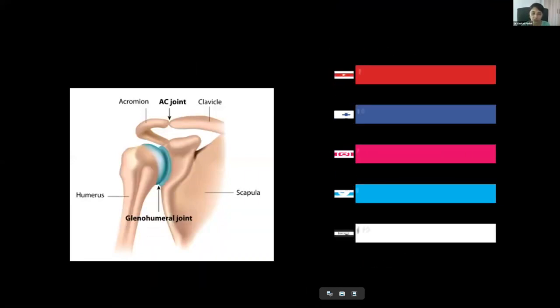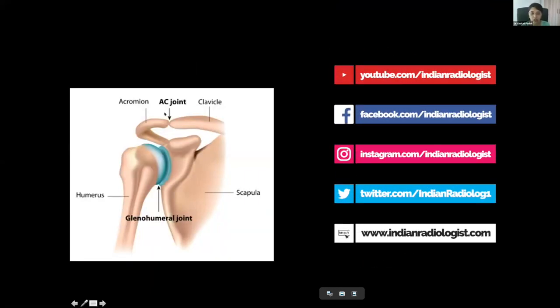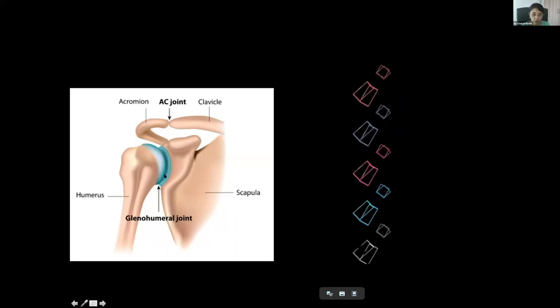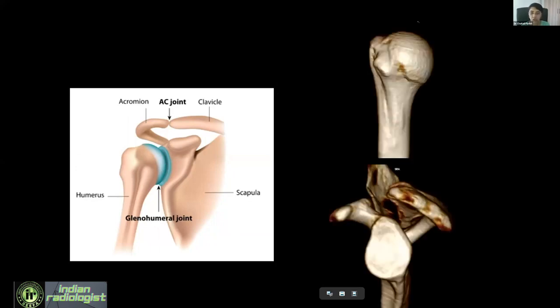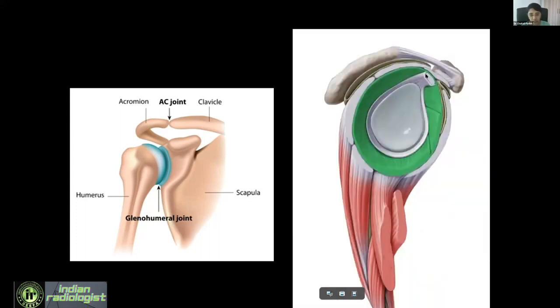Whenever you do an MRI shoulder, there are two joints that you're going to cover: the glenohumeral joint and the acromioclavicular joint. We'll concentrate on the glenohumeral joint first because it is the more important joint. It's a ball and socket joint where the ball is the humeral head and the socket is the glenoid of the scapula. The humeral head is larger whereas the glenoid is more flattened, which provides more mobility but comes at the expense of instability. To provide more stability, there are soft tissue structures around the joint.